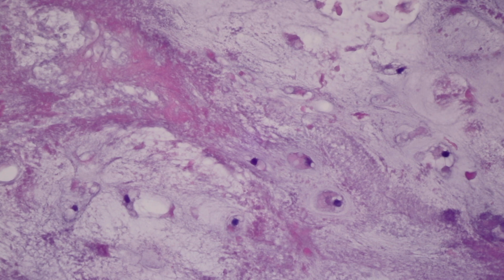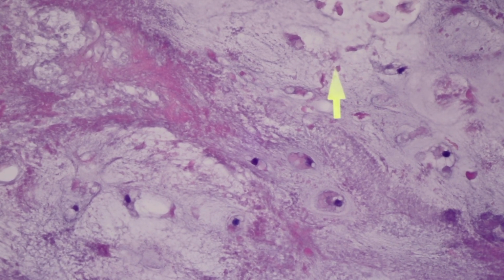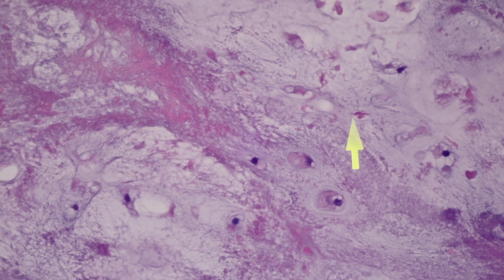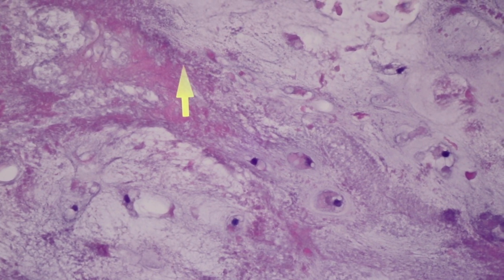They're a little distorted, and you can see this sort of amorphous, purple-like material within the cartilage. That represents mineralization of the cartilage. And if you notice, in this field, in this area, we see necrosis of chondrocytes, and it's in the area of mineralization. So the question is, what is the significance of chondrocyte necrosis in determining the biological potential of a cartilage neoplasm?